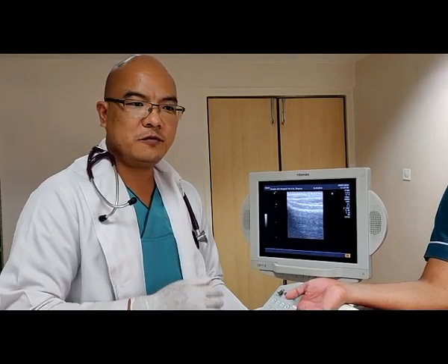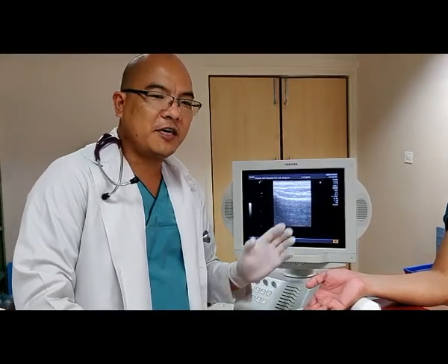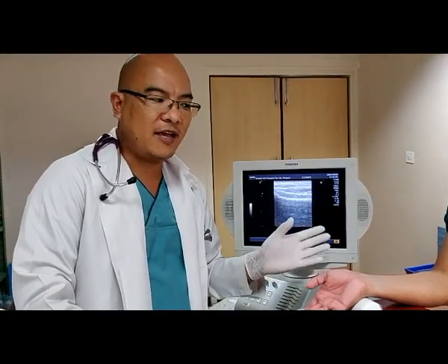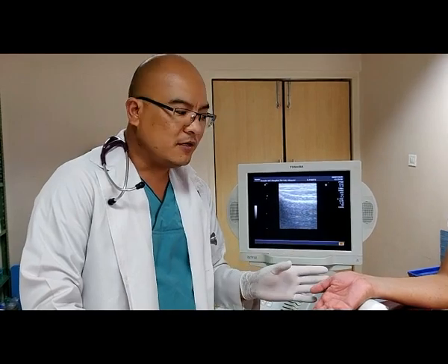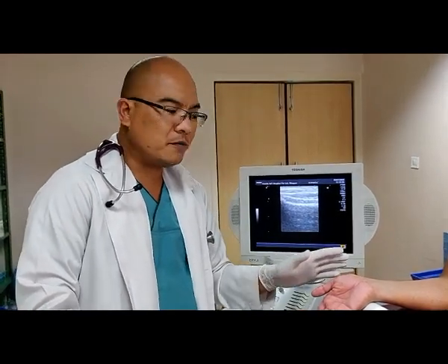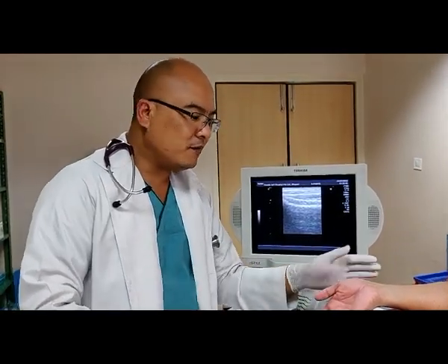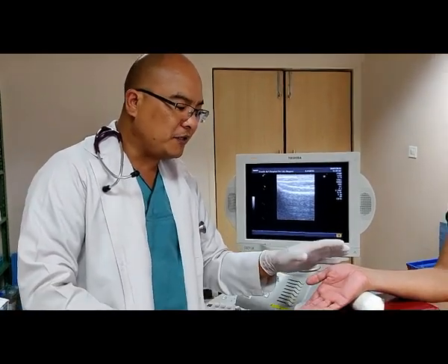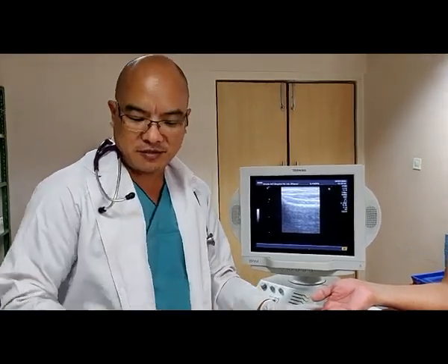Before initiating the procedure, we need to clean our area of insertion with chlorhexidine. We need to keep our patient's hand at 45 degrees to align the artery, with a cushion underneath. And we need to tape it to stabilize the patient's hand.